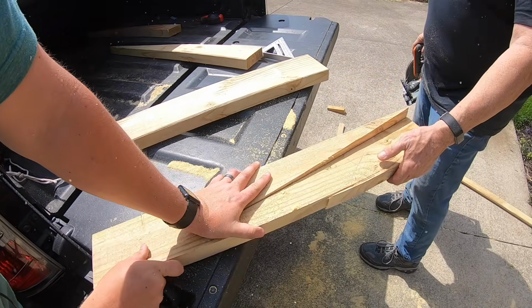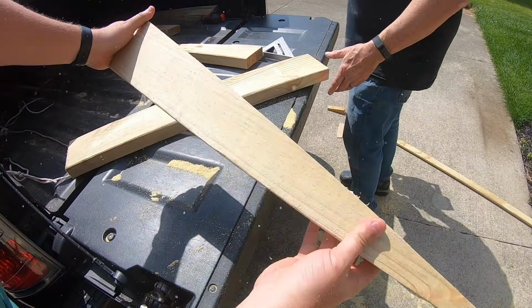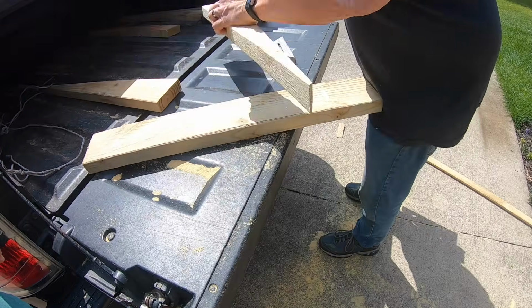So after you've cut it, you got that, which is your scrap piece. It's got the X on it. This is your good new piece, that's exactly what we want. And then you're gonna go ahead and do it with the next one as well. So we got 2 of those done, got 1 left to go.